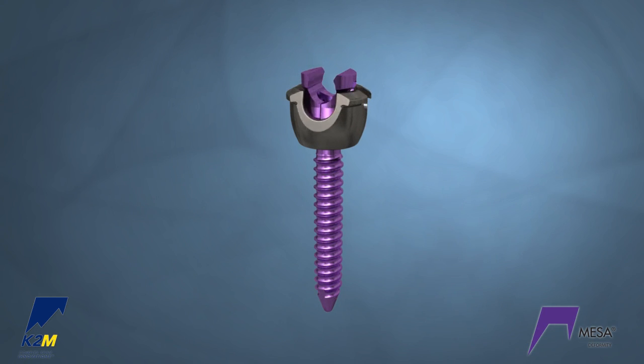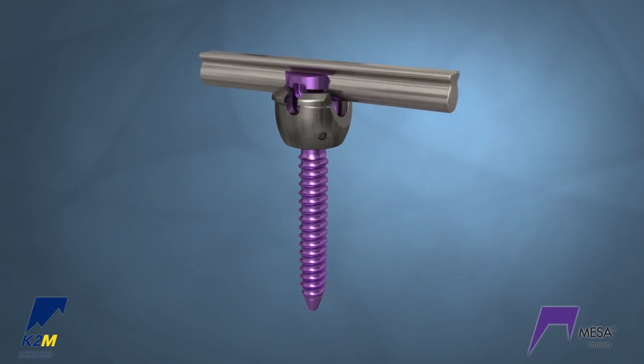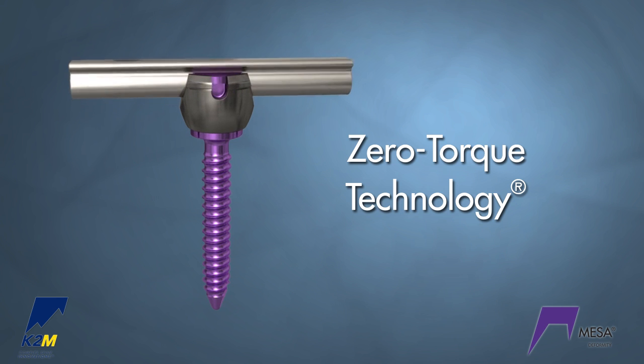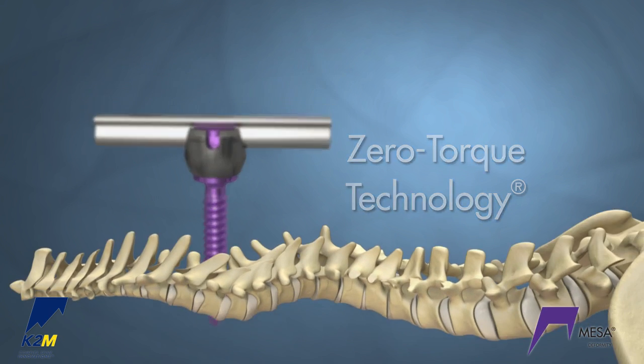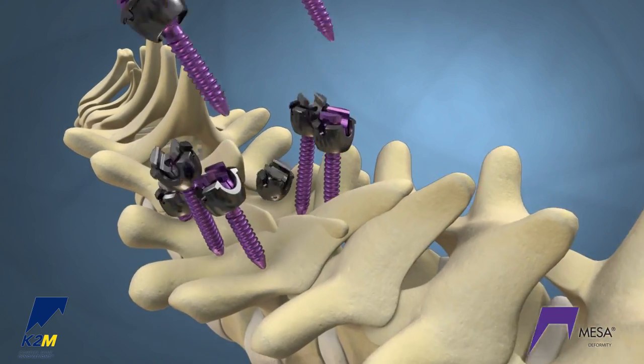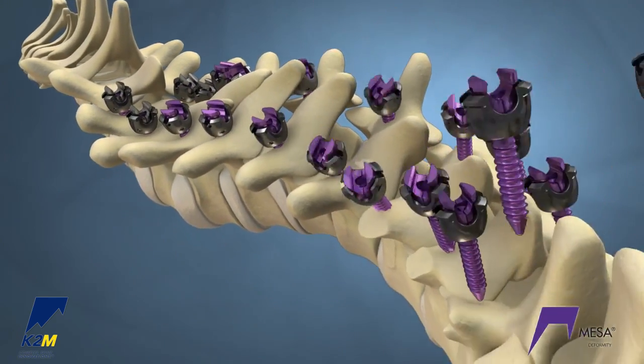The MESA screws are low-profile implants. The screws feature zero-torque technology, requiring no torque for final locking, and when locked, have no profile above the rod. Polyaxial screws are anchored proximally, and deformity uniplanar screws are used throughout the rest of the construct.